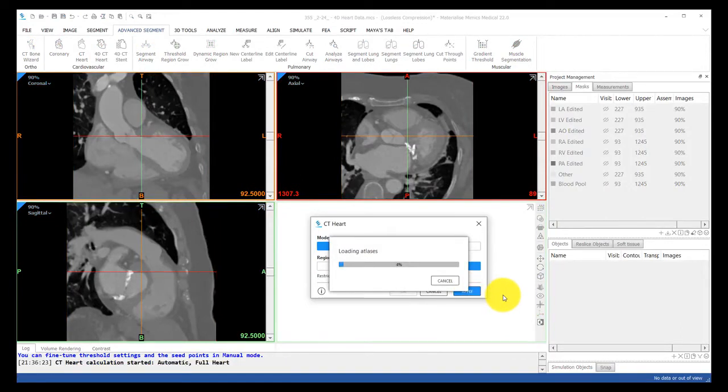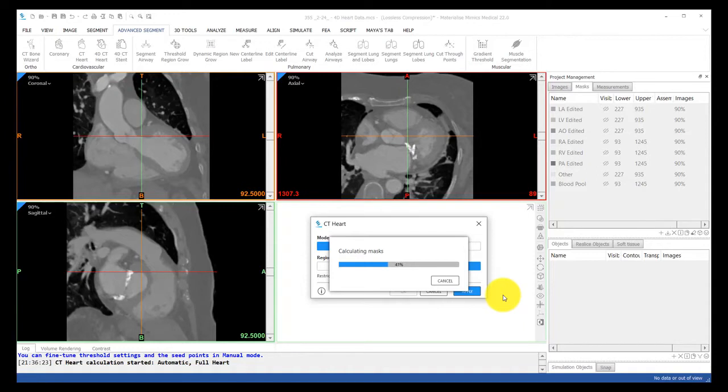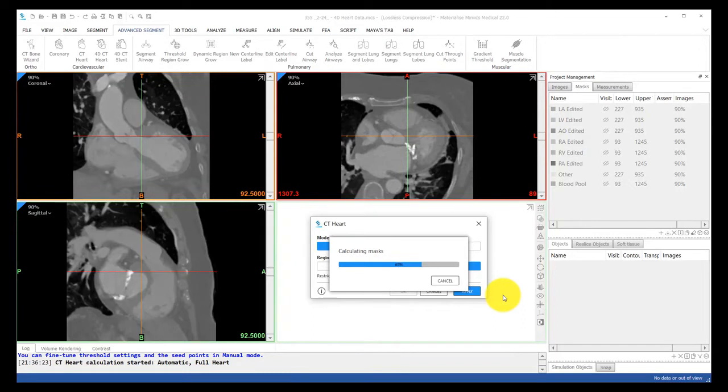The manual method is really more like a semi-automatic method where you select seed points in the scan for each part of the heart, and the tool will segment the heart automatically based on that and based on the contours or gradient changes in the images. I would recommend to always try the automatic route first, and then if this doesn't give you the result you're looking for, you can use the semi-automatic method.